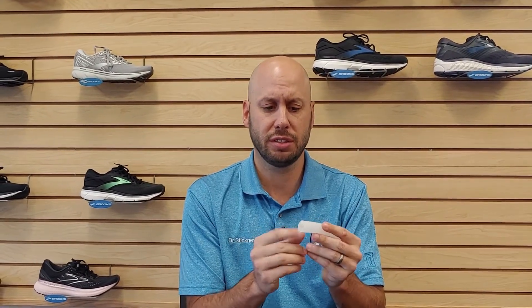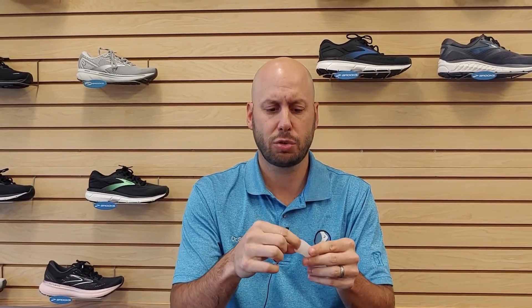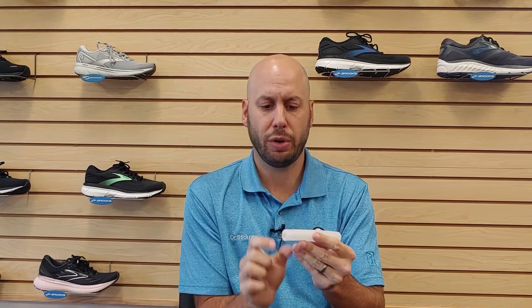A silicone toe sleeve is a very nice soft squishy sleeve that will slide over a toe. It comes long, and what we'll have you do is cut it to the size that you need to fit the actual toe.